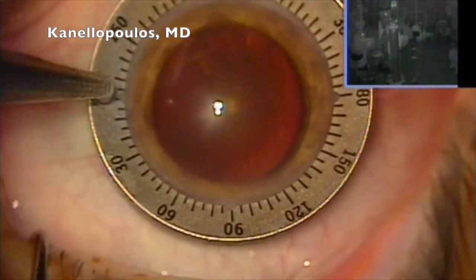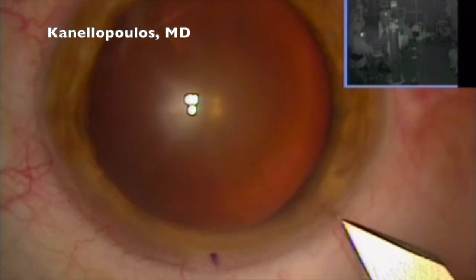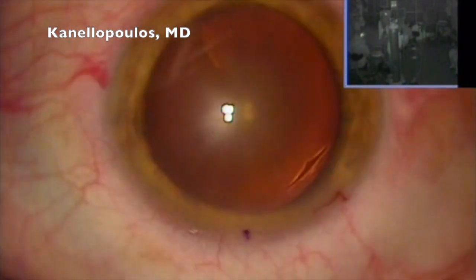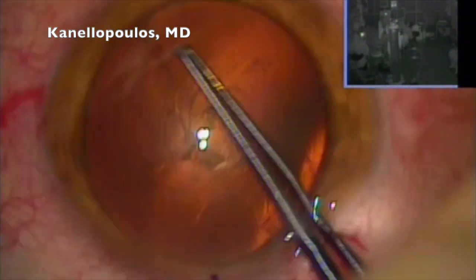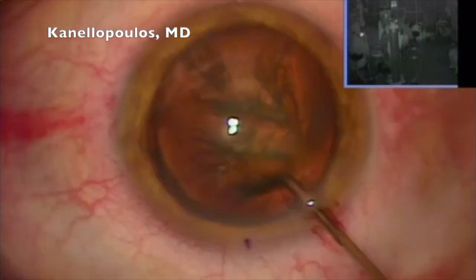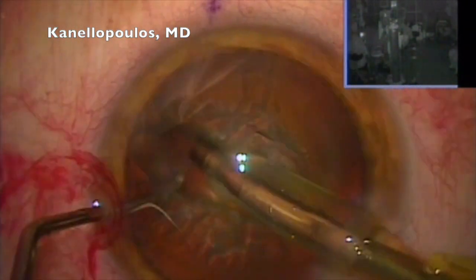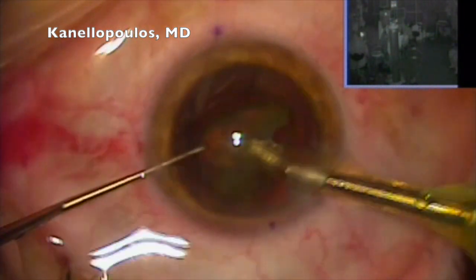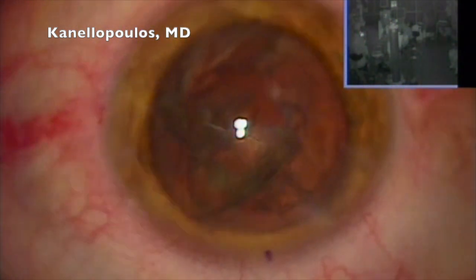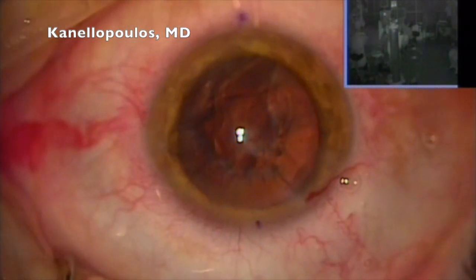Right eye now, it's a T3 at 91 degrees. Our angle measurement, I go in always at 135, and this is embedded in my formula. Again, almost a copy of the previous procedure, just the lens power changes. We opted, this is his non-dominant eye, to aim for about a -1.5. I'm very keen on working with astigmatism in most patients. I have an impressive statistic of using 90% toric intraocular lenses, and we play with mild blended vision, plano to -1/2 in the dominant eye, and this enables us to have vision better than 20/20 since we're using toric lenses.